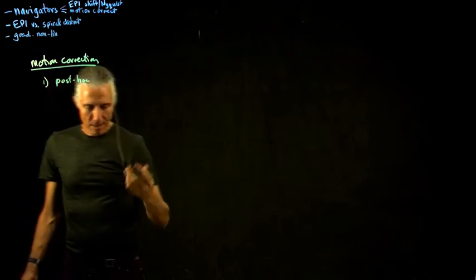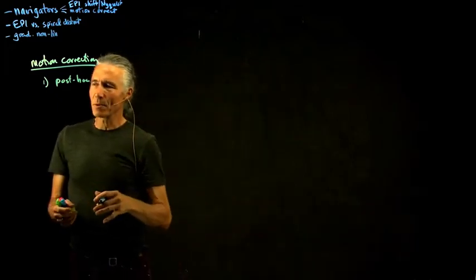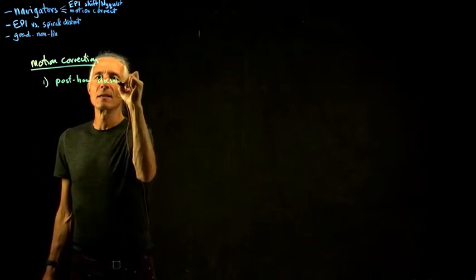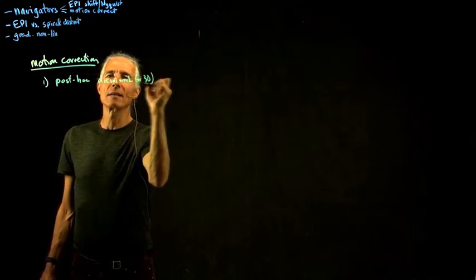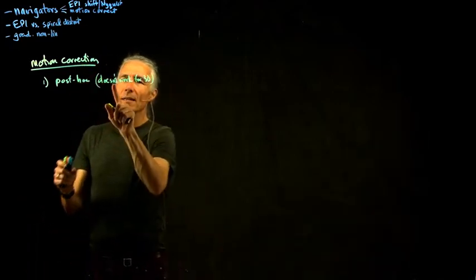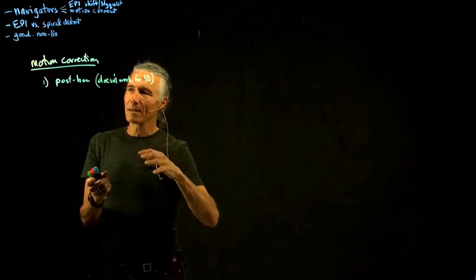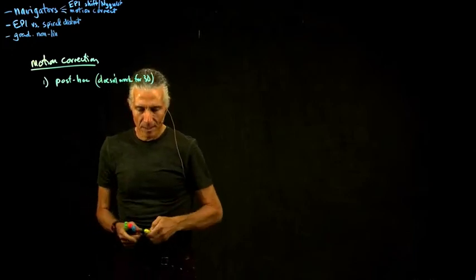So basically just line up each volume as it comes in with the previous one to fix that. That doesn't work for 3D. If you have a 3D scan, like a 3D echoplanar scan or an MP Rage, you're not collecting the data, and you're not assembling the image until the very end. So if motion got in there, there's no easy way to fix it because you don't have an image to align yet, because you haven't made the image.